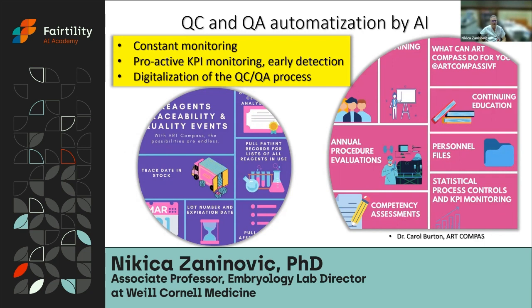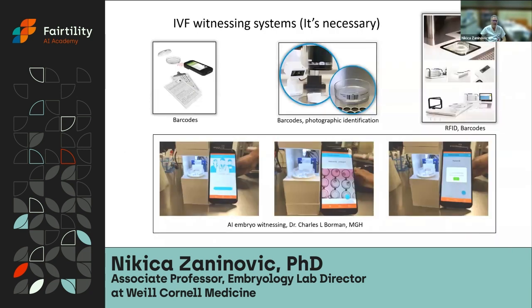So that's what we are trying to do. We are trying to do this in some preemptive way. Of course, in the IVF lab nowadays, you do need to have some kind of electronic witnessing system. It's not enough that you have multiple humans witnessing each particular dish, each particular tube, and verifying the name of the patients. That's not enough. It's not efficient.